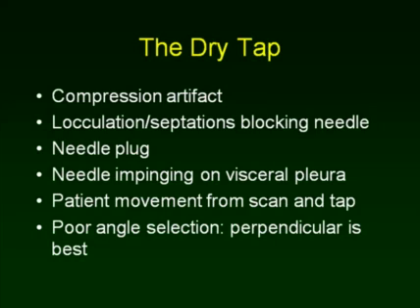There, just have to go in a little further. A heavily loculated or septated effusion may block the needle. The septation is sucked into the needle and just blocks it. Sometimes some tissue plug, as the needle is inserted, gets into the needle.